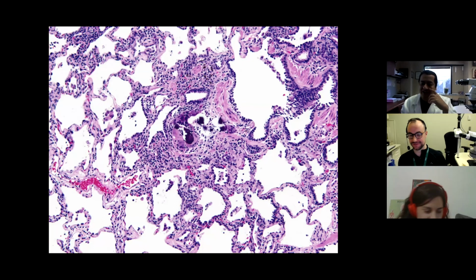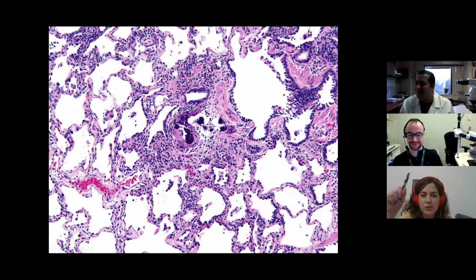HP, hypersensitivity pneumonitis. You see the giant cell, the beautiful interstitial lymphocytosis. I have to say it. Yes. Matt waited until the air trapping. I saw him. He waited until the air trapping.